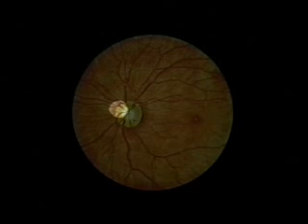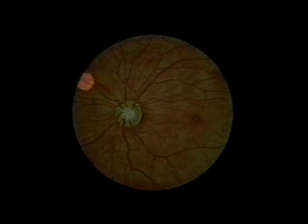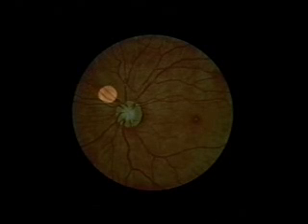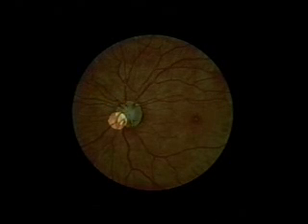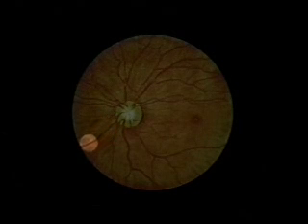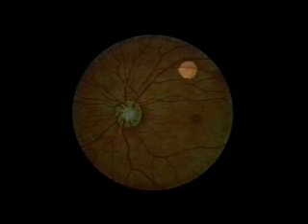Moving your head and instrument as a unit, inspect the retinal vessels and adjacent retina by following the vessels from the disc to the periphery in four directions. Note the relative size and color of the smaller, lighter arteries and the larger, darker veins. Look for changes, such as nicking of the veins at arteriovenous crossings. There should be none.